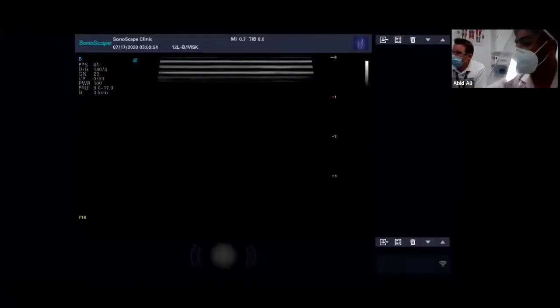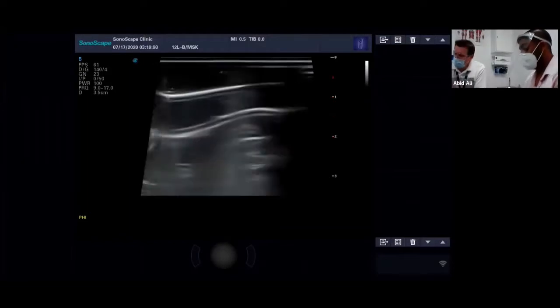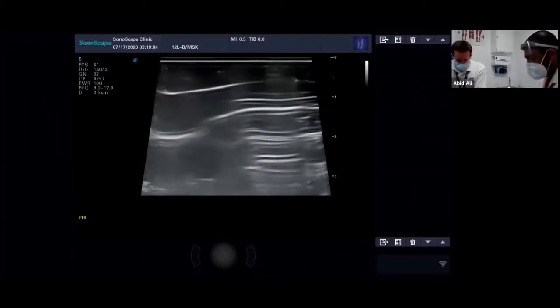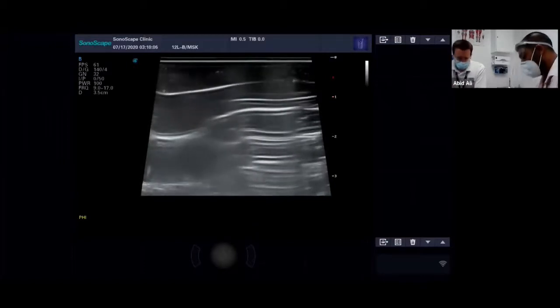Okay, so let's get plenty of jelly on our probe first of all. Adrian's camera is on my probe. What we're going to do here, we want to look at the anterior ankle.